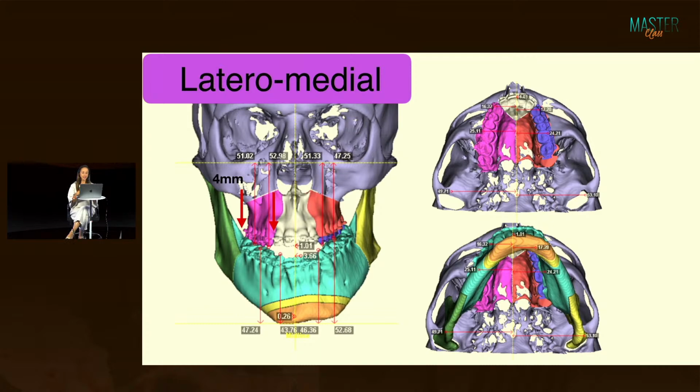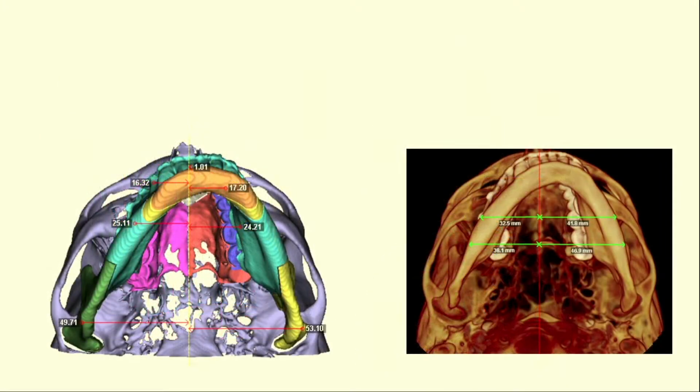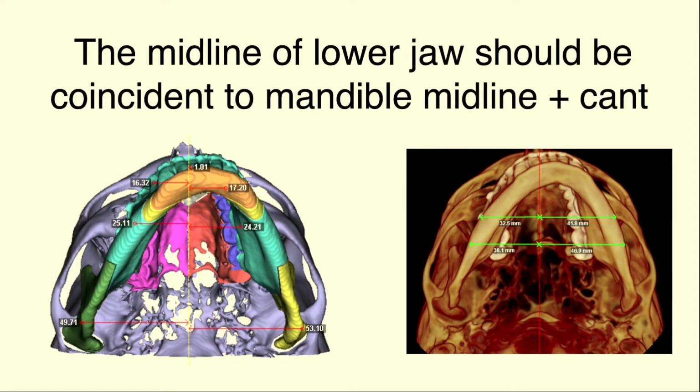So the right side and the left side are totally different because of the bone asymmetry that this patient has in the maxilla and the mandible. And this is the good orthodontic preparation. I have a chin discrepancy of 4.5 millimeters, and I have a discrepancy in the cant of the mandible of 4.5 millimeters too. So all these measurements, we can calculate from all the planning that I'm suggesting for this patient.